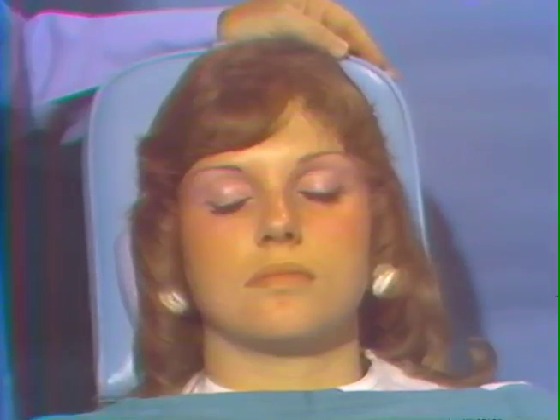There are three primary nerves to anesthetize in the palatal area of the maxilla. They are the right and left greater palatine nerves supplying the posterior aspect of the hard palate, and the long sphenopalatine or nasopalatine nerves supplying the anterior portion of the palate. The palatine nerves come through the right and left greater palatine foramen. The long sphenopalatine nerve emerges through the incisive foramen. To produce topical anesthesia for these injections, proceed in this manner.